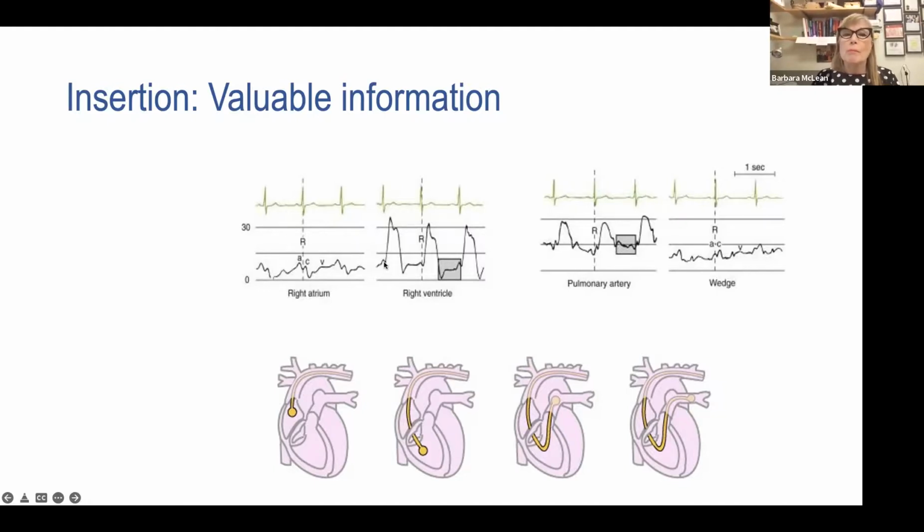So you see you have this big upstroke of systolic contraction and then a rapid fall down. And remember, I mentioned that before, to a plateau. Big ejection up, rapid fall down to a plateau. So this is pressure, pressure, pressure, empty, empty, empty, and starting to fill. Pressure, pressure, pressure. Now that valve has opened, pulmonic valve, empty, empty, empty, and now we start to fill. And that's what that plateau is telling you, filling, right?